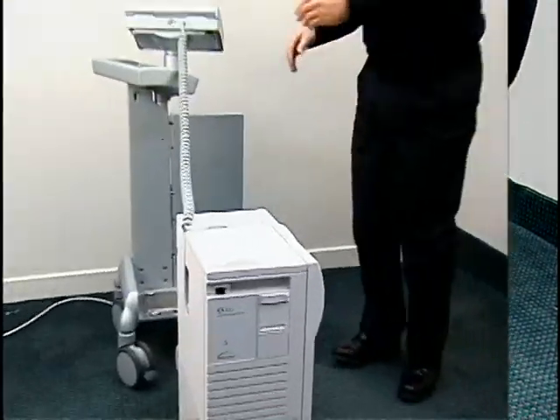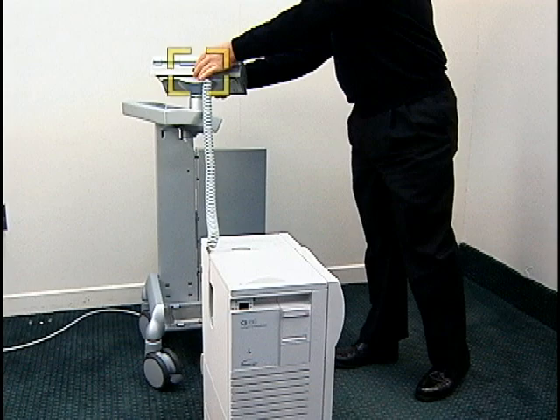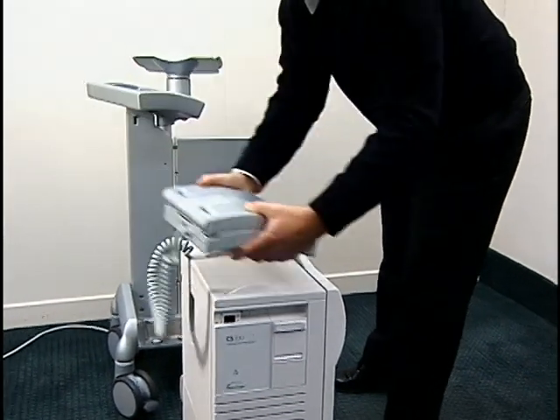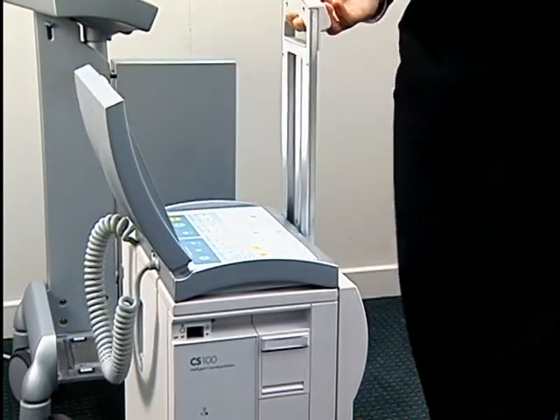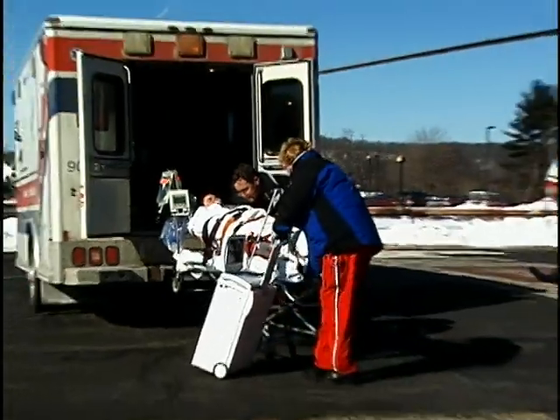To attach the monitor to the pump console, detach the monitor from the cart handle by pressing the button on the rear of the monitor here and attach the monitor to the top of the pump console. Make sure the monitor is securely attached before moving the system. Extend the console handle until it locks into position. Tilt the system and pull to transport as shown.